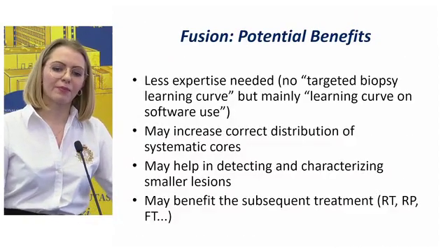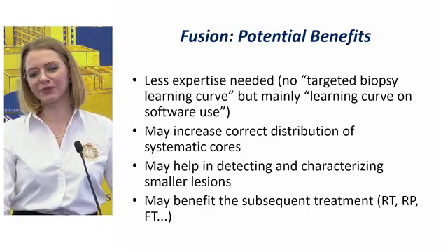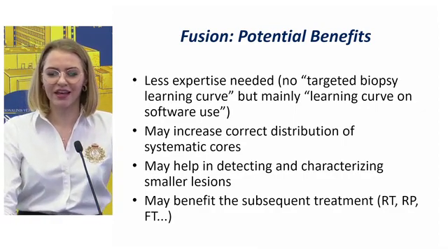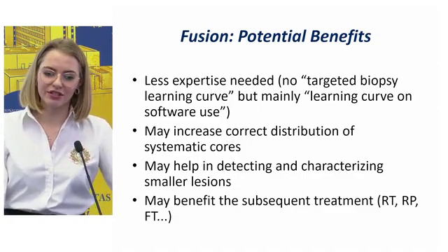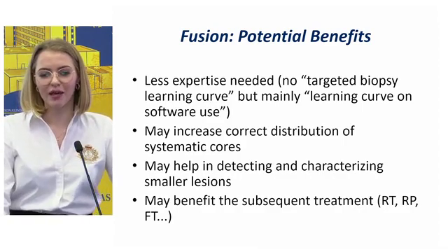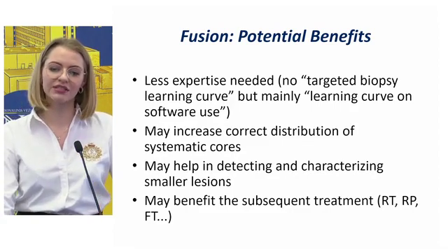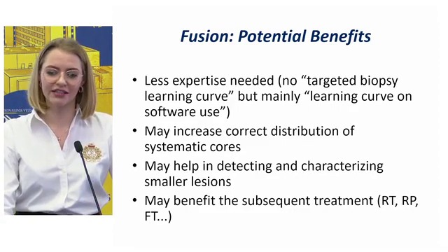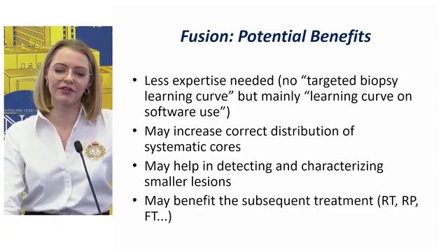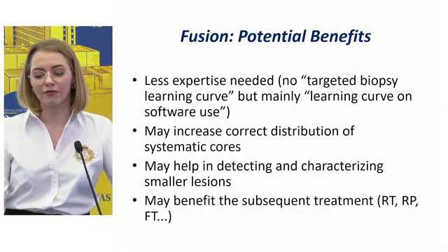So the potential benefits of fusion biopsy are that less experience is needed, so younger doctors can probably perform it better. No targeted biopsy learning curve is needed, but mainly a learning curve of software use. It may also increase the correct distribution of systematic cores. It may help in detecting and characterizing smaller lesions, and it may benefit the subsequent treatment: radiotherapy, prostatectomy, or focal therapy.